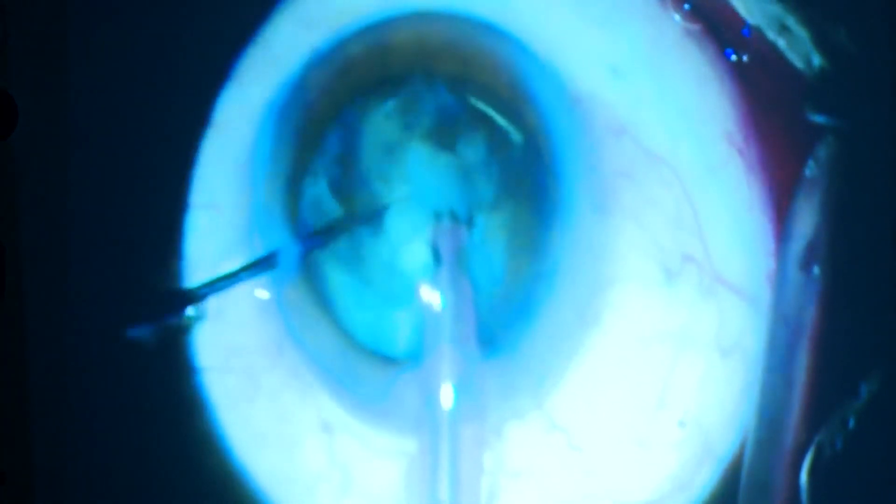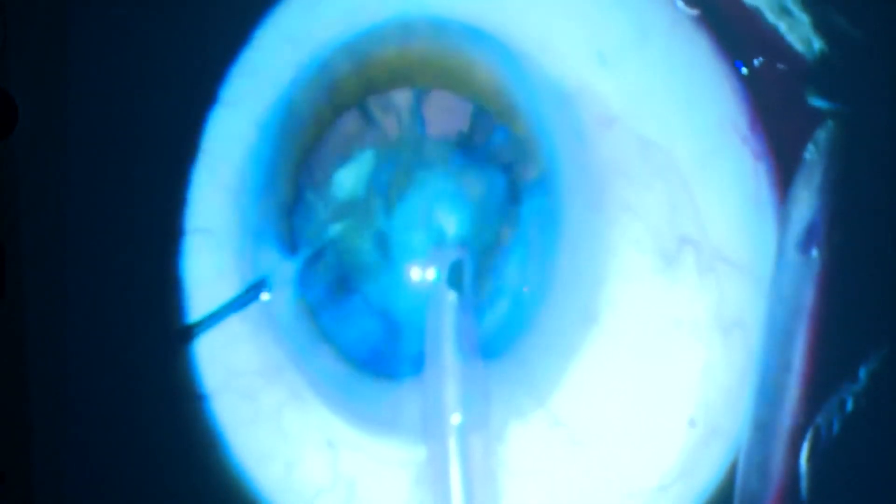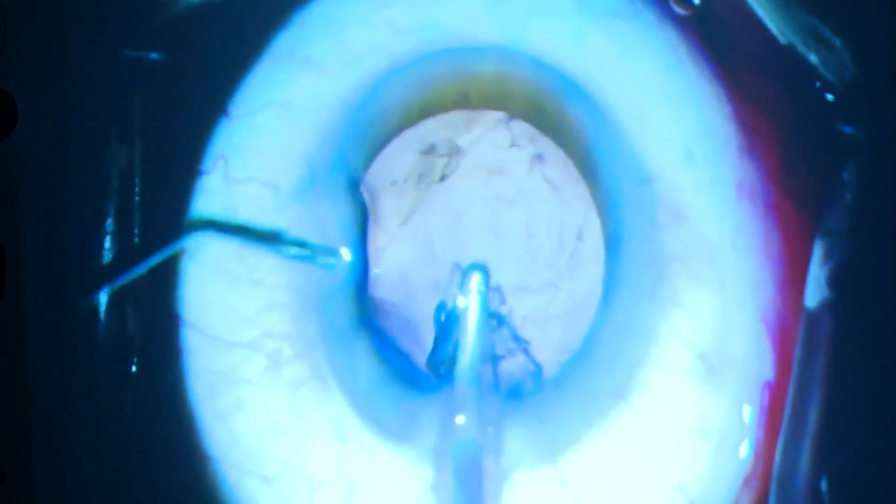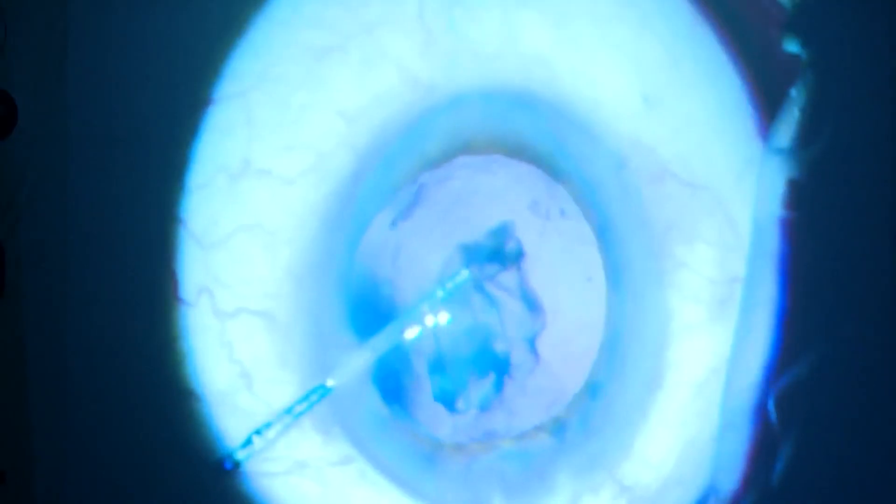Without manipulating, without rotation, just by realignment, the nucleus pieces are taken out. Mind it — the posterior capsule is ruptured, nucleus sclerosis is there. You don't want to do any hydrodissection or hydro-delineation. Deepen the AC. Here also, there's a strong epinuclear mass. Now comes the situation where you can do a dry aspiration. The dry aspiration is done and you will see that you have been able to take out the material in spite of the fact that the posterior capsule was ruptured. Again, an oval rhexis to your rescue and the job is done. You have saved two patients wherein the capsule was already ruptured. Job done. Thank you very much.